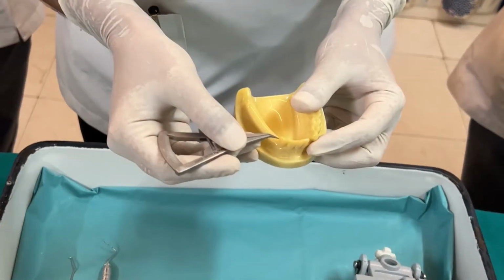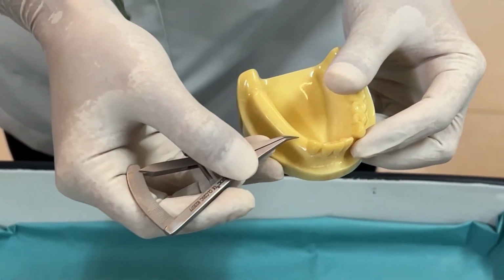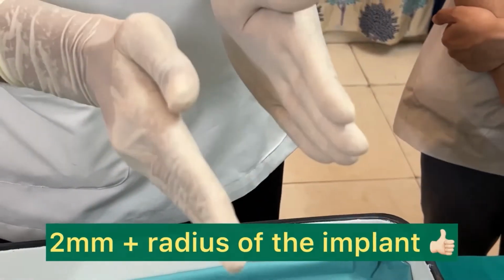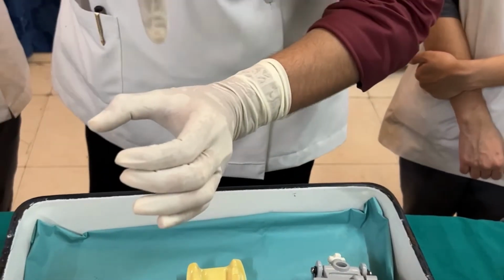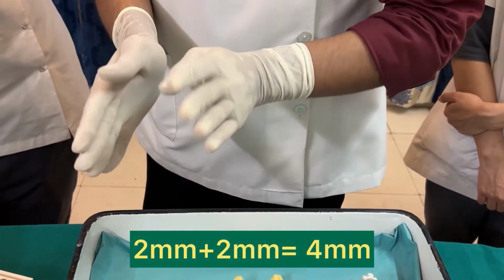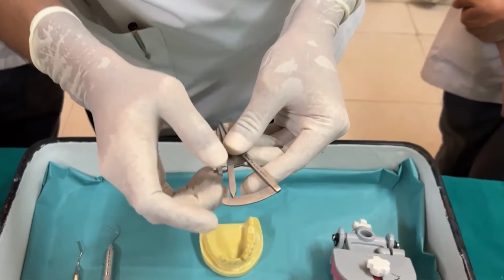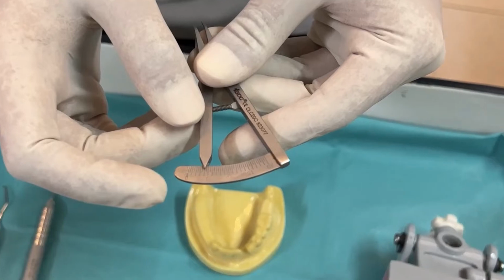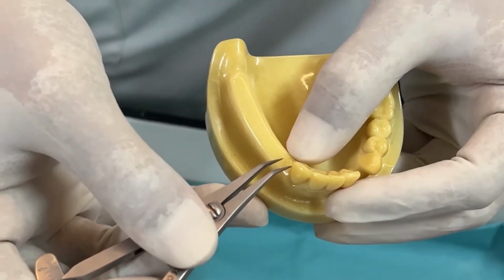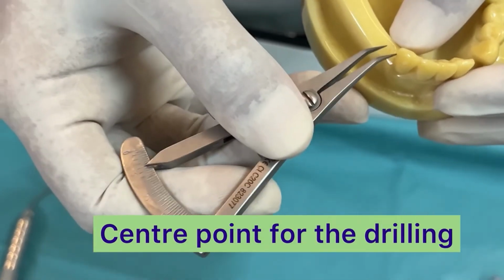Suppose I want to know, for a 4 millimeter implant, at which point should I do the drilling? It would be 2 mm plus the radius of the implant, because my drill would be going in the center of the implant. So how much would it be? 2 mm plus 2 mm, that is 4 mm. Meaning if I set this vernier caliper, which we also call a bone gauge, and I mark a 4 millimeter point here, that would be the point in the center at which my drill should be hitting.